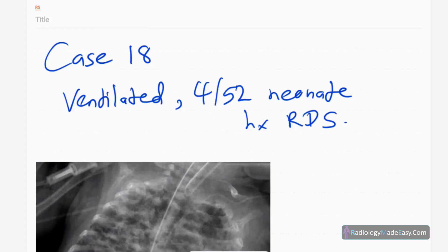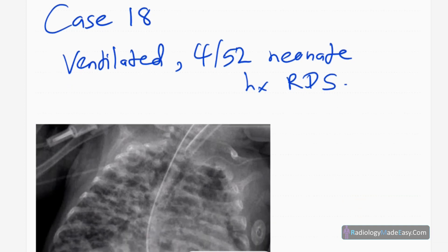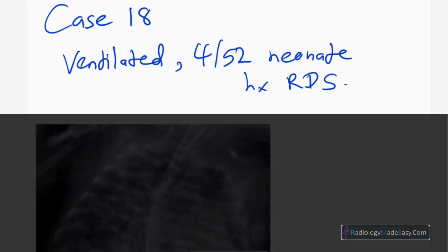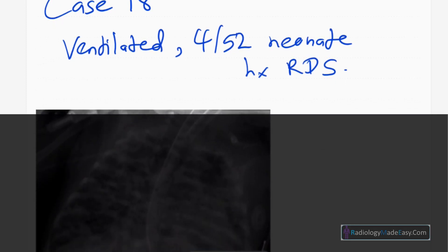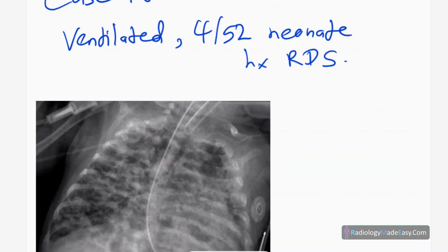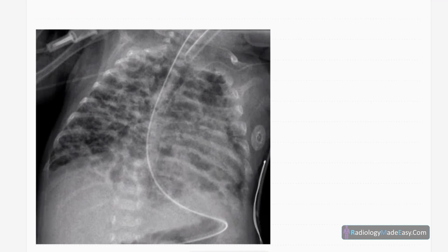Hello everyone, this is case number 18 of our series in radiology. Today our patient is a four-week-old neonate who has been ventilated, and there is an issue of neonatal respiratory distress syndrome due to prematurity.